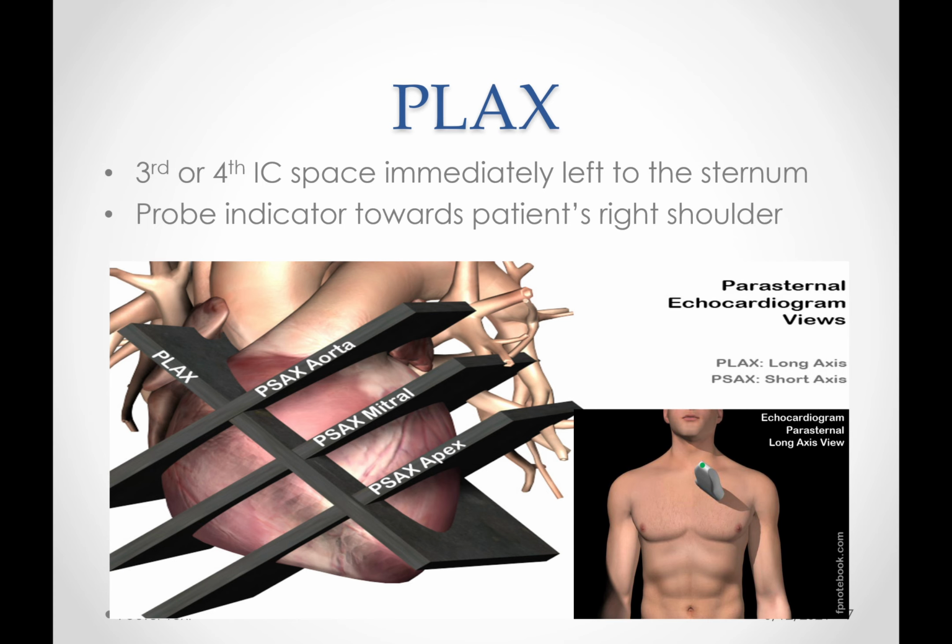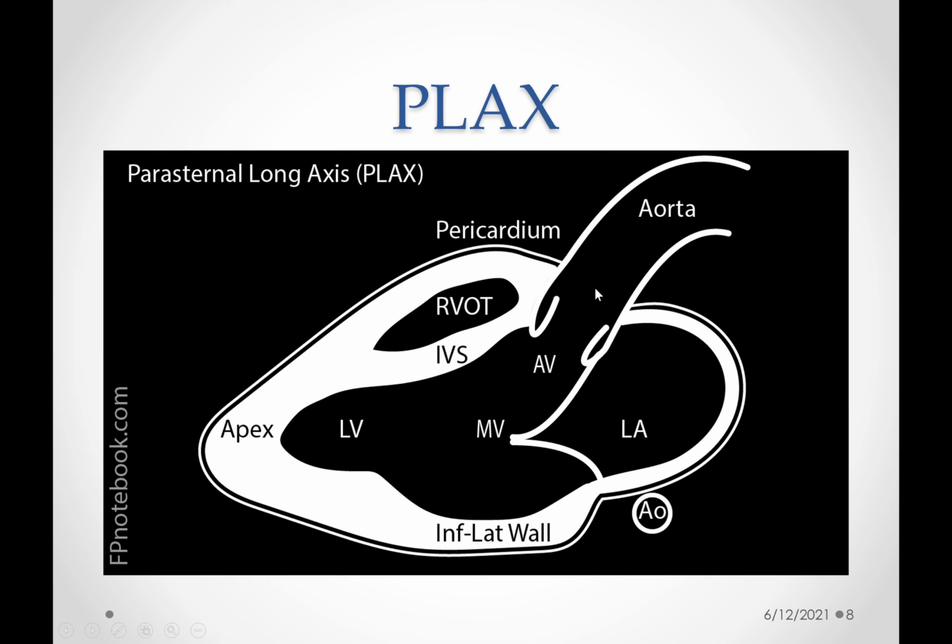On your right is your left atrium, and then the flow goes through the mitral valve to the left ventricle on your left side, and through the aortic valve, through the aorta or the left ventricular outflow tract. On the top side of the picture, you can find the RVOT, which is the right ventricular outflow tract.